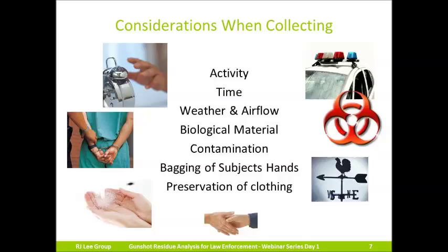We also want you to consider packaging. When you are packaging clothing to be sent for sample collection, the items should be packaged individually so no contamination or cross-contamination in this instance could occur. Each article of clothing can be wrapped in butcher paper and then placed in separate evidence bags.